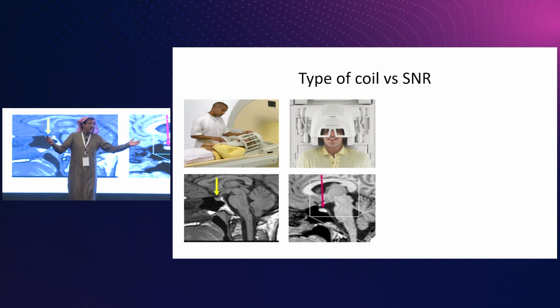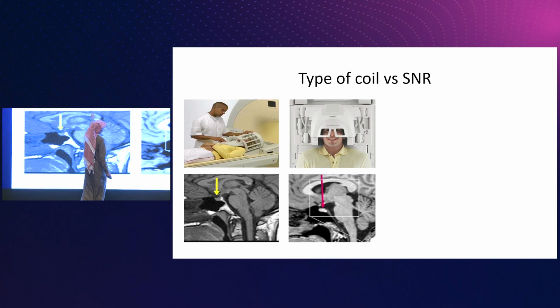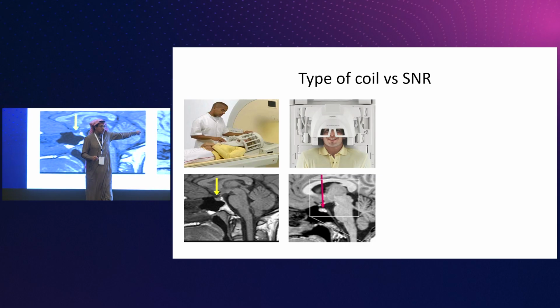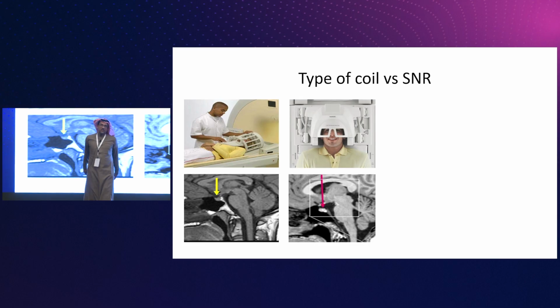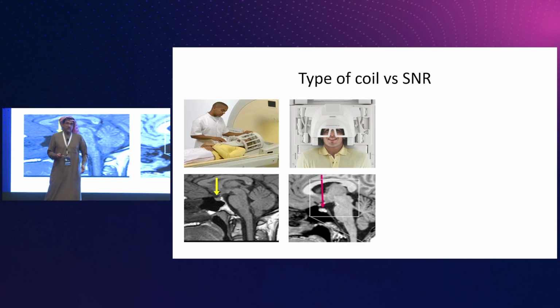I did nothing, I just changed the coil. Where I work, we have both, so we always use the high resolution coil unless it's an infarct. An infarct doesn't need a very small coil, and you can't put him in the big one, CVA.